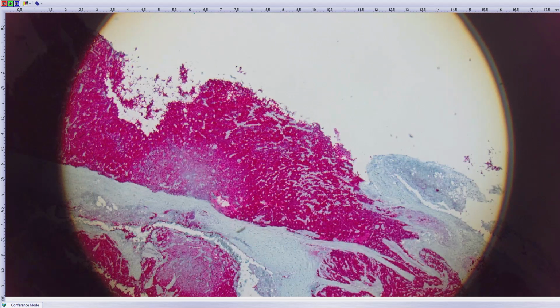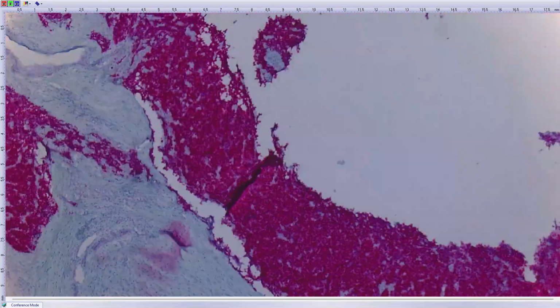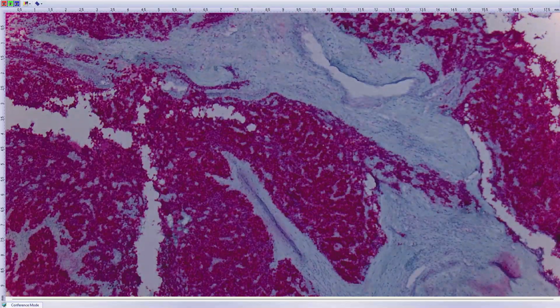And the other good marker is NKX2.2, also not perfectly specific, but when you see diffuse nuclear staining, such as here, again, you highly increase the probability this will be Ewing sarcoma. And when you have this morphology, clinical, and immunohistochemical constellation, I would suggest not to order NGS. I would just go for FISH if you have it available. FISH not only for EWSR1 but also for FLI1 and ERG, because it will be much faster. You will have results in 3 days if your lab works well.